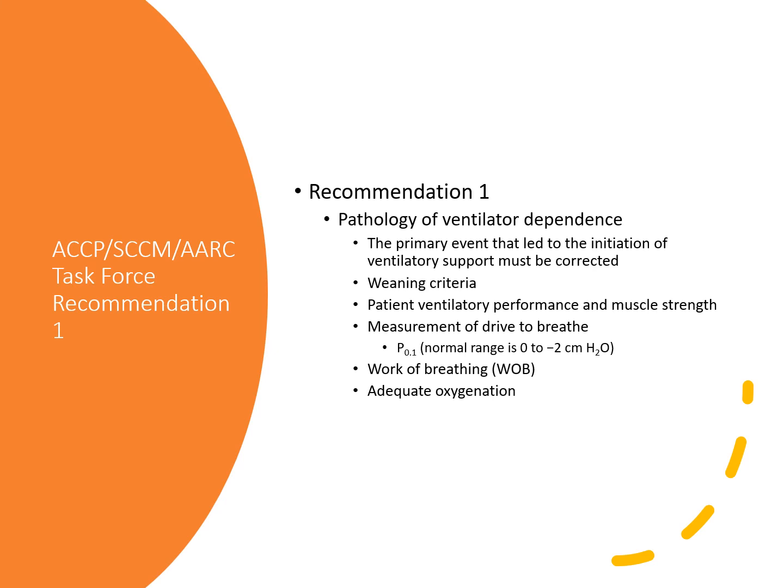The vital capacity hasn't been shown to be a good predictor for some patients, because it's only looking at muscle strength for one breath. And it also requires patient cooperation, which is not always consistent, especially if they're a neurotrauma patient. What about the rate, the tidal volume, RSBI? You can do that with a bedside PFT device, a respirometer, or like I said, a lot of ventilators can do that as well. You just have to go into certain modes to see it.